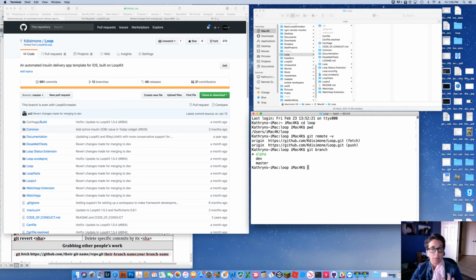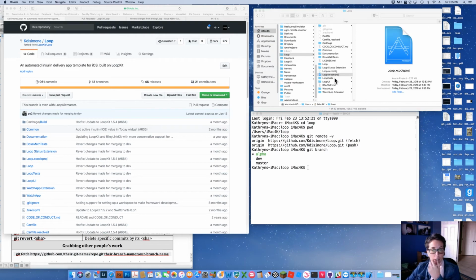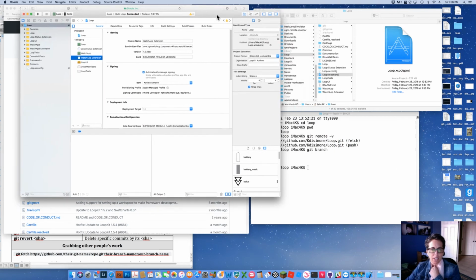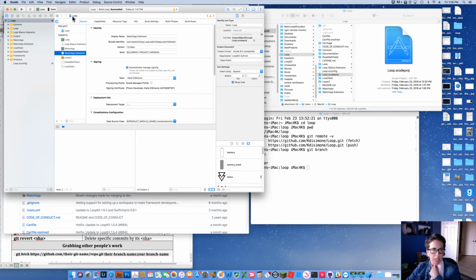So I was busy in Xcode building some stuff before this video started and had some changes in there, and I'm going to go ahead and probably take those out. If I open up loop project right now in Xcode, it will give me my files and what I was working on. So that's cool. One of the things you'll notice, and I'll give you a heads up what's going to happen here, but you see this little M? That stands for modified. That means I changed something in the files that hasn't been recorded properly by Git.